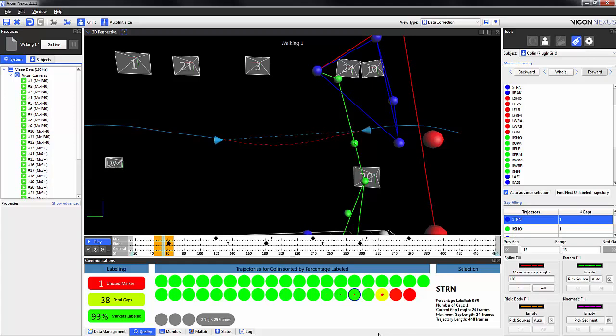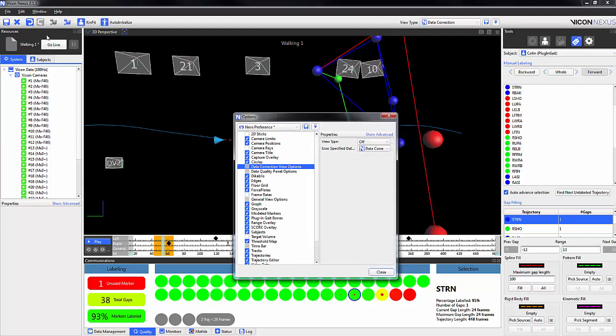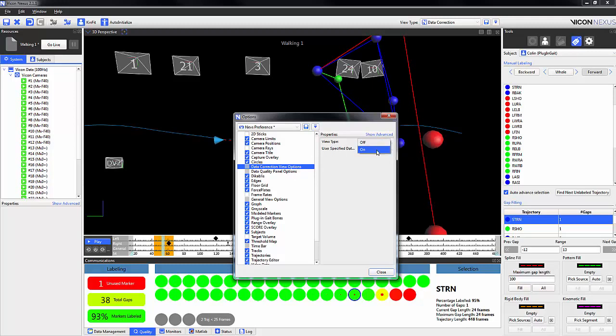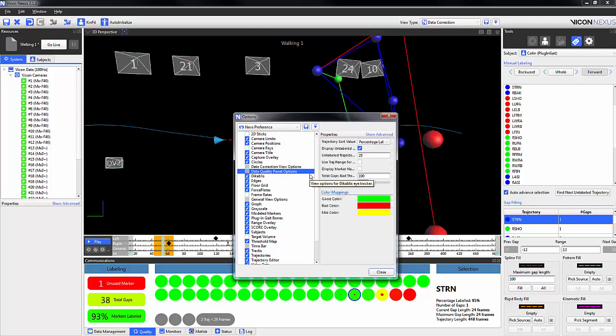To enable this feature, we need to go to Window, Options, or we could press F7, and highlight Data Correction View Options. We need to change the View Type to On. We can also change the Data Quality Panel options, such as Trajectory Sort Value, among others.